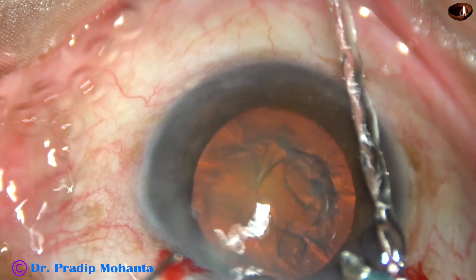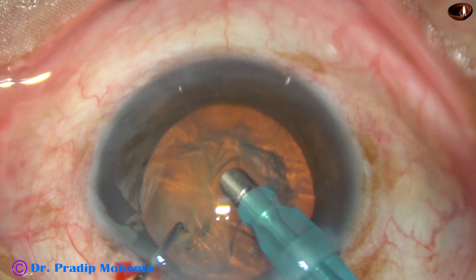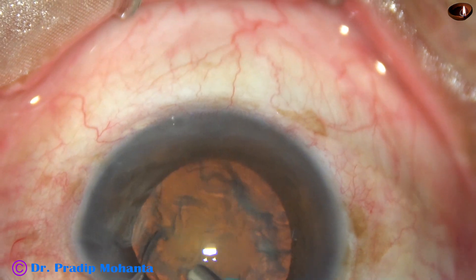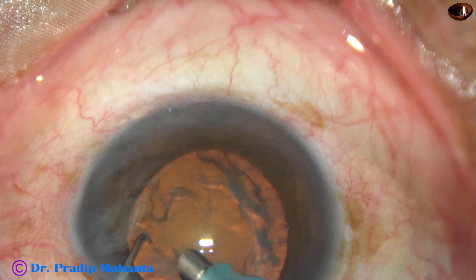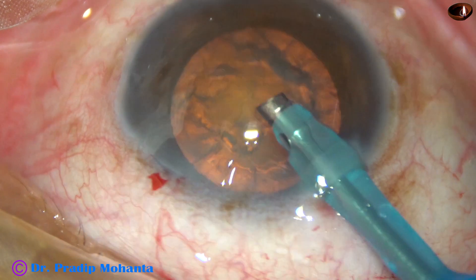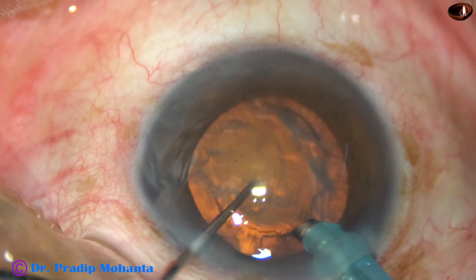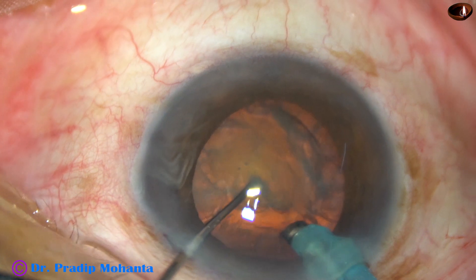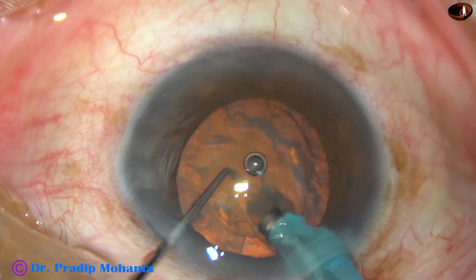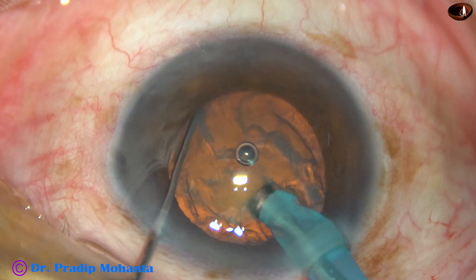Let us see this in slow motion. This is 50% speed. The tip goes beveled down. Some superficial cortical lens matter is aspirated. And now the handpiece is turned — bevel is up. A small pit is made just in front of the main incision, between the center of the nucleus and the equator, just in front of the main incision. This is the pit, and the nucleus is being supported without vacuum.